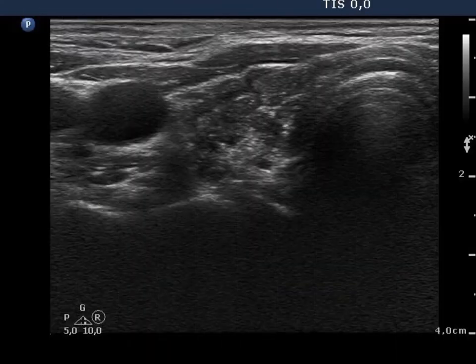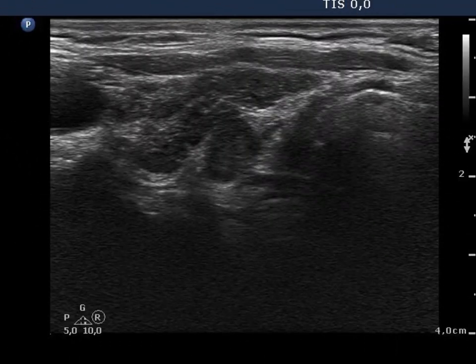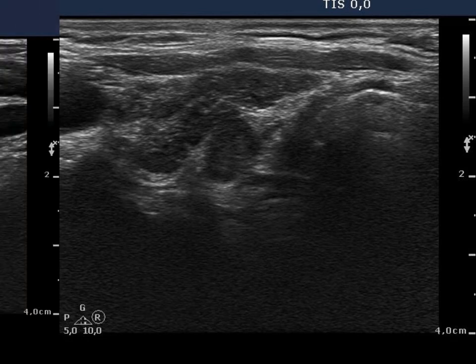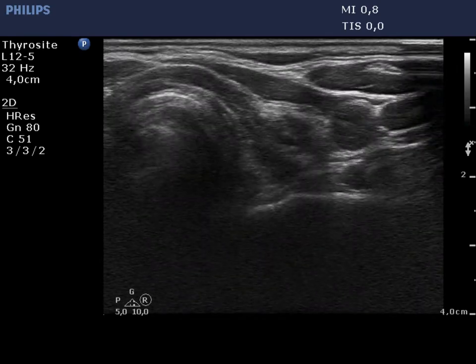The echo pattern of the right thyroid corresponds to the underlying Hashimoto's thyroiditis. The lobe is hypoechoic, inhomogeneous, and presents fibrotic changes and discrete circumscribed areas not fitting a nodule in a pathological sense.